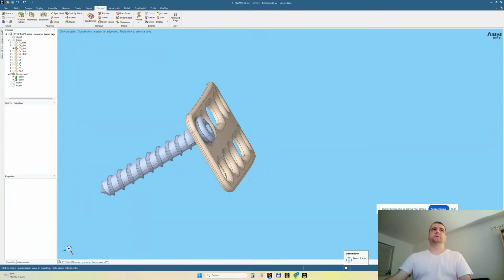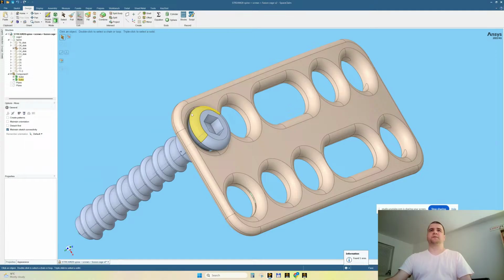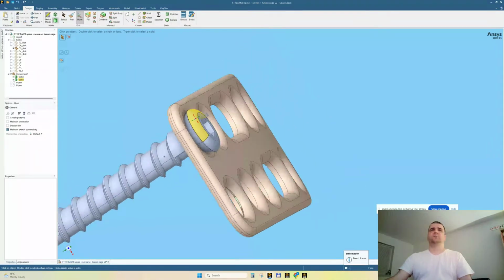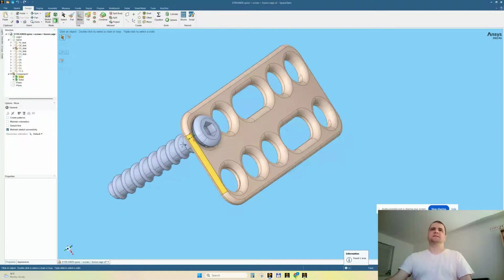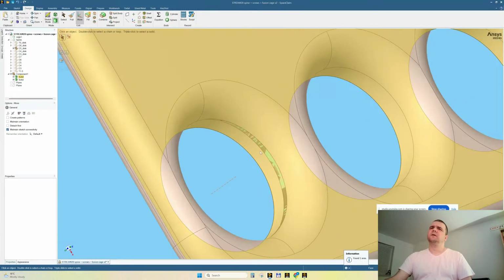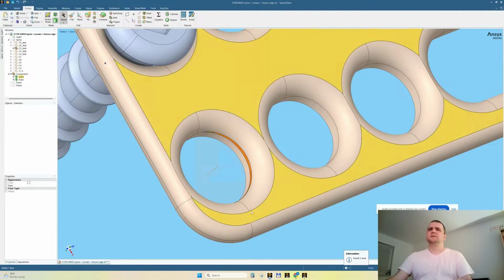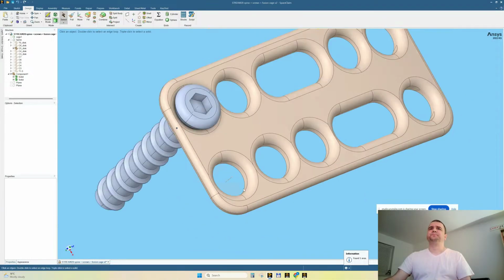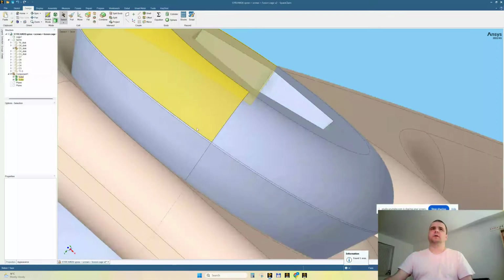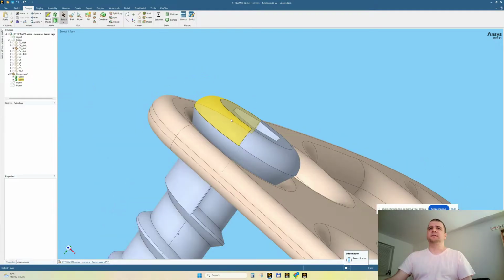All right. What we are doing is design move. I remember the collision was on that side. I can move it, but I can also rotate the screw. What should I do? I can translate it, but I can also rotate it because it's clear to me that the screw is not properly aligned. What is this? So the screw is not properly aligned with the hole. Why do I need this small sliver of surface? I don't need it.